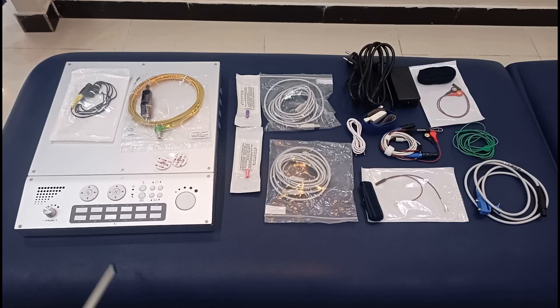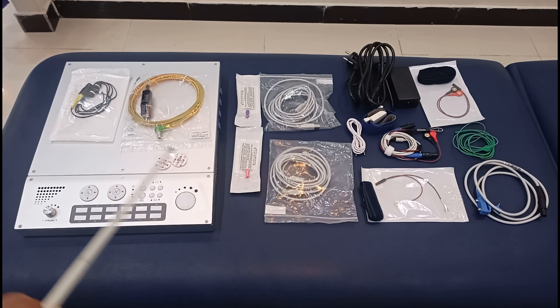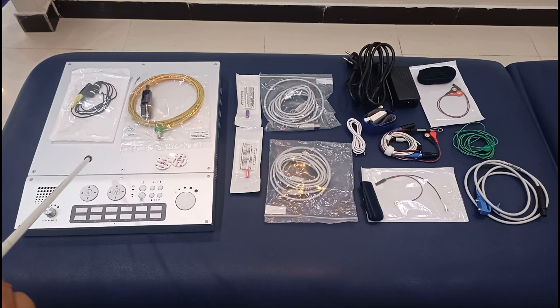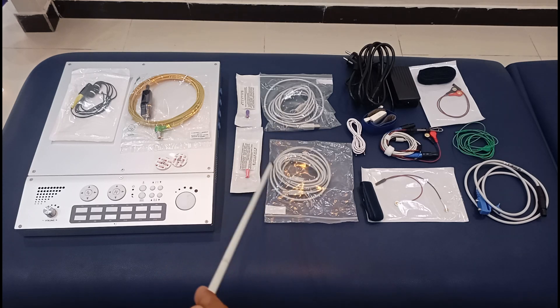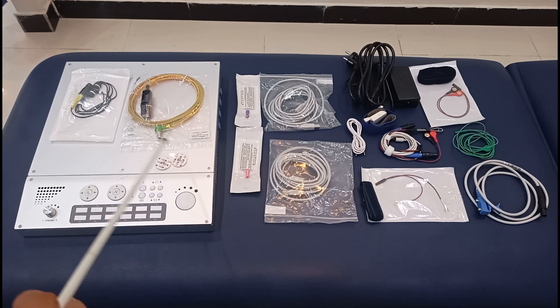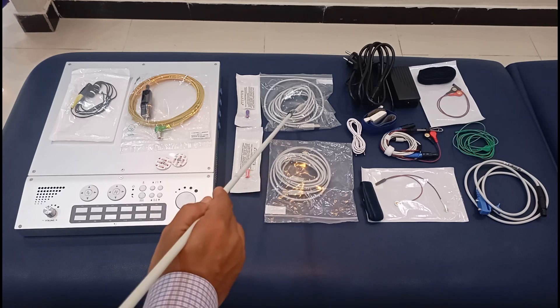Today we are going to talk about the NCS and EMG machine by Contact. This is the main unit and everything you see here is going to be connected to this unit. This unit does not come with a display, so you need a laptop to connect it using two USB wires, and you need a software to operate this machine. When you buy this machine, a software comes with it that you can install and use.